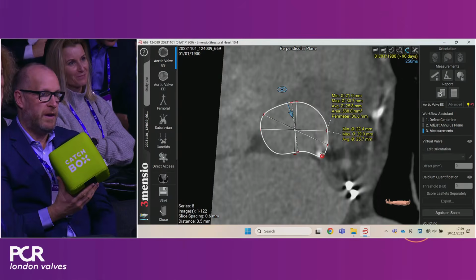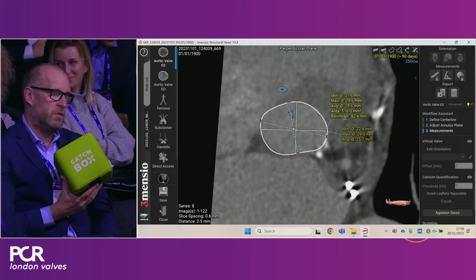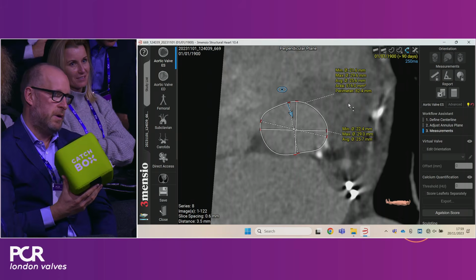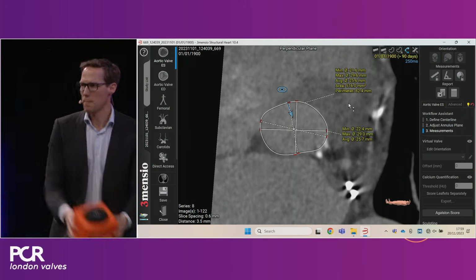So you want to track it. So we are not exceeding 29 here, so the reasonable choice can be the 29. Perimeter 82, so again, it's absolutely a borderline case. Yeah, probably both work. Anybody else? Yeah.